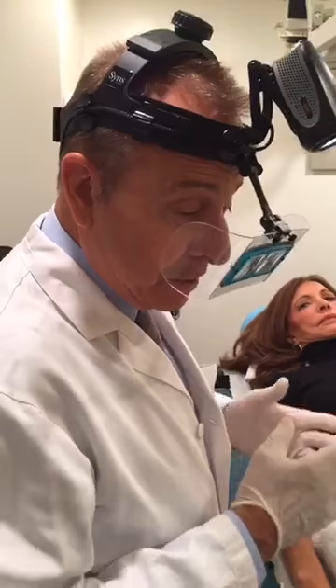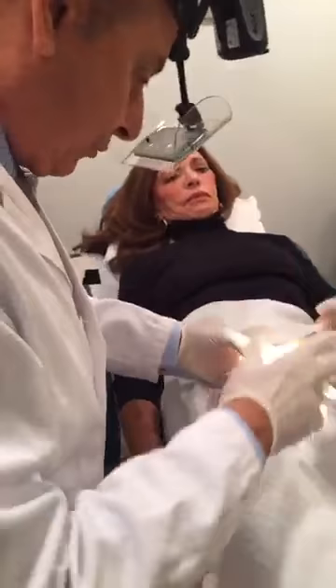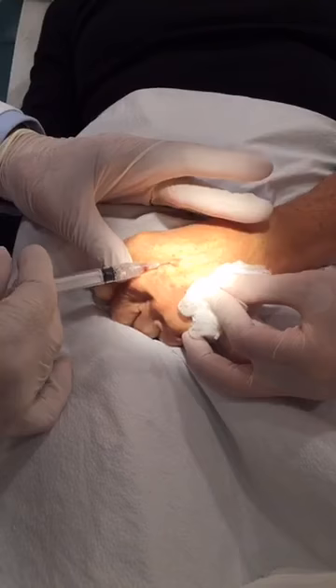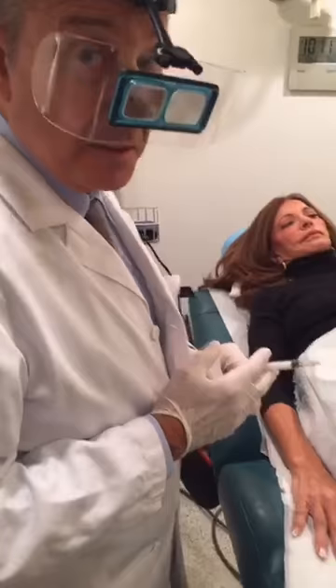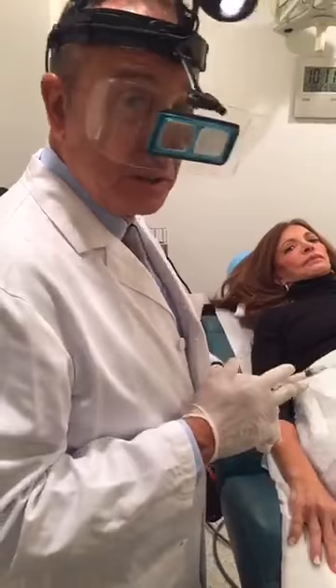What type of injections are you doing to the hands today? That's typical sclerotherapy — the injection of a chemical compound that irritates the inner lining of the vein so that the vein collapses and the body will absorb the vein. The blood is rerouted through the deep system of veins, deep in the hand. It's basically painless, and the results are excellent. One to three sessions and the veins will disappear completely.